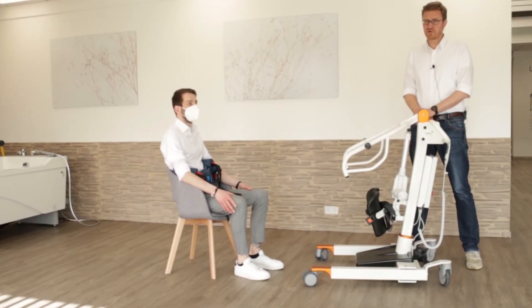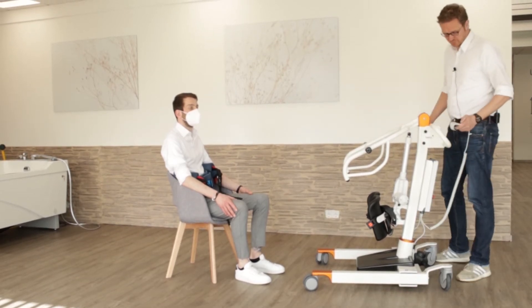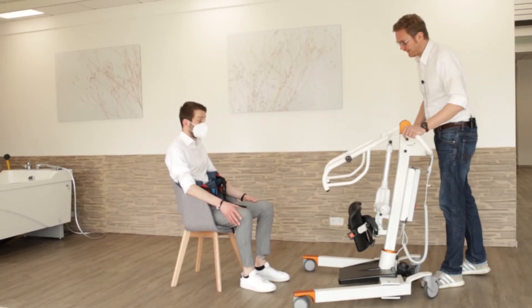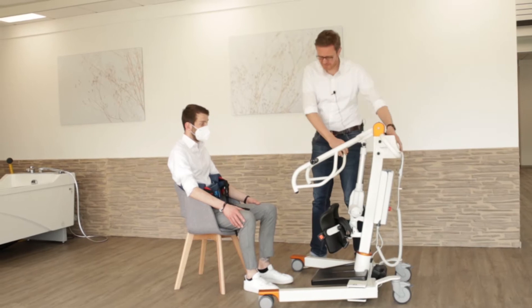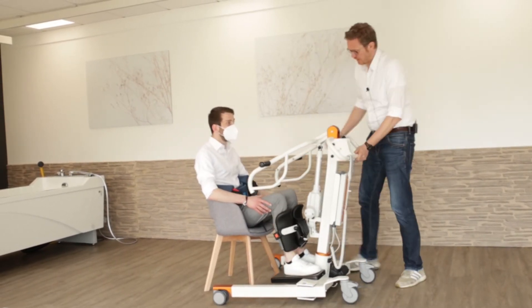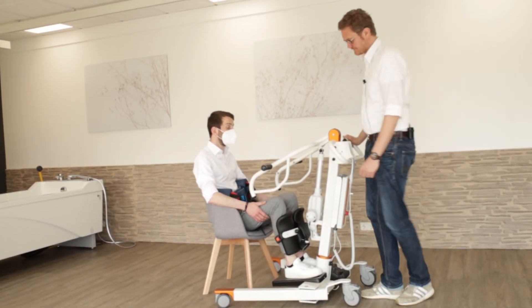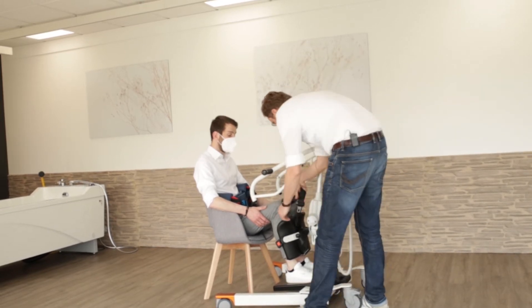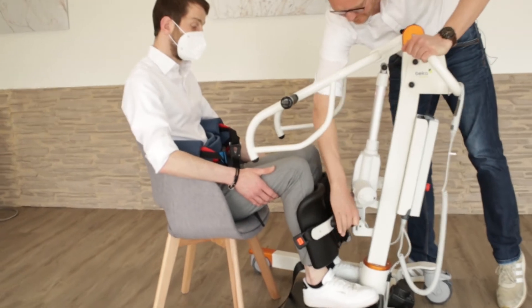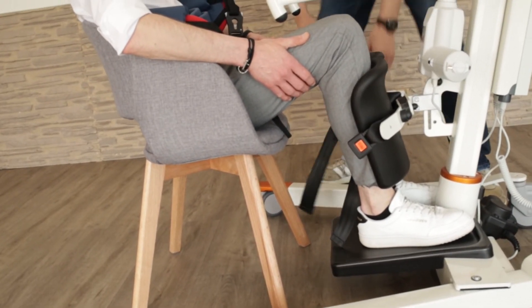Now I want to show you how we're positioning the Nora and actually lifting the patient up. We spread the legs of our Nora, positioning it in front of the patient. If our patient is able to move his feet, we ask him to put his feet on the footplate. You can decide if you want to use the brakes to secure the Nora in front of the patient. And we adjust the safety belts on both sides.